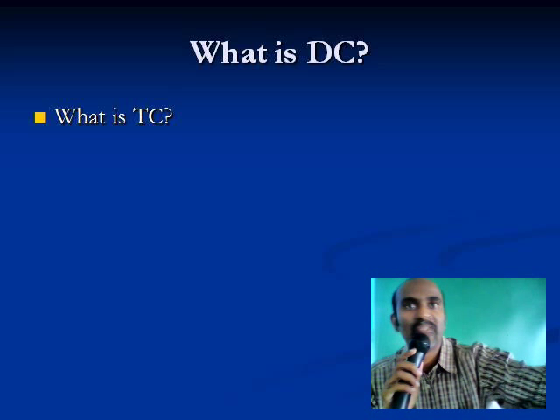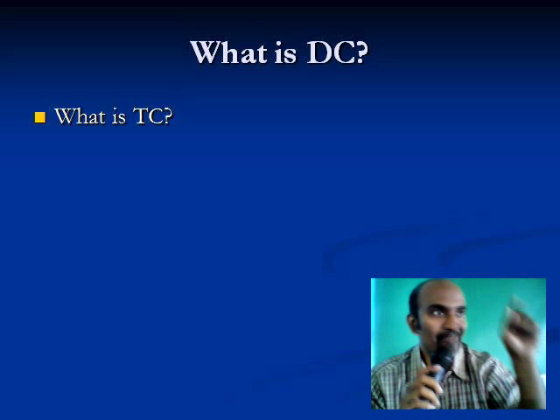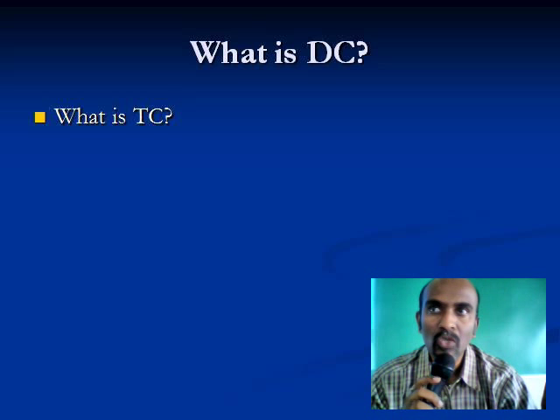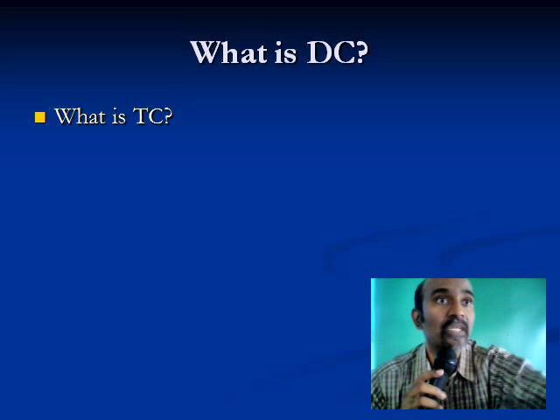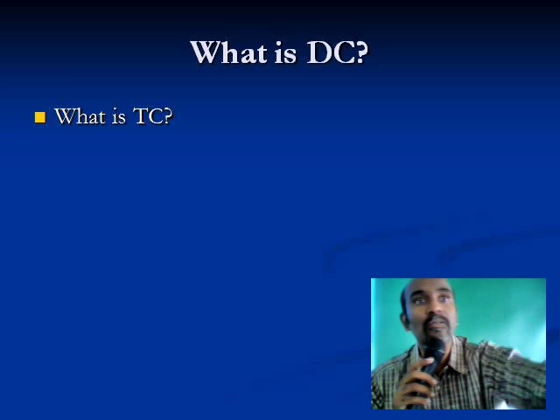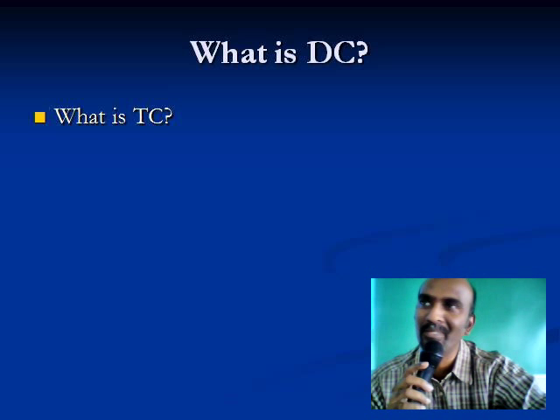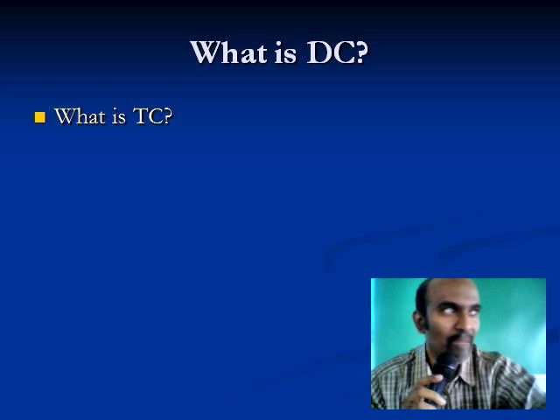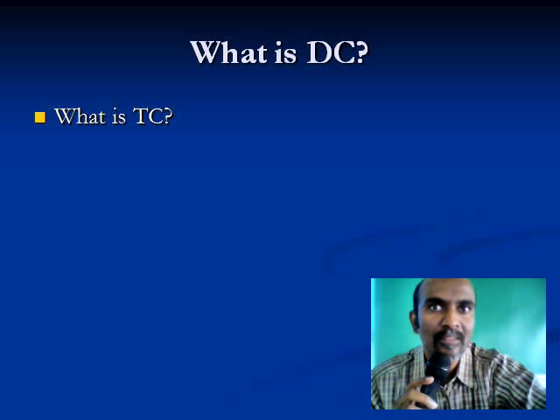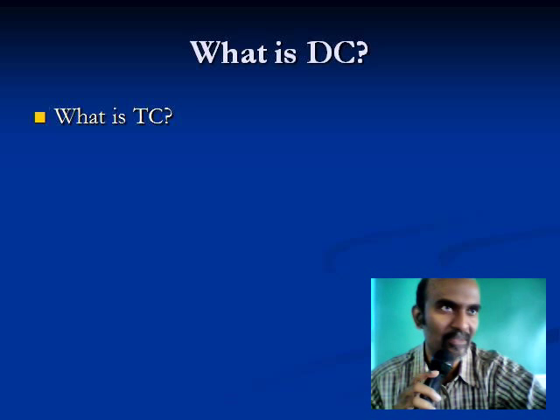We have read neutrophils, eosinophils, etc. And we want to find out how many neutrophils per millimeter cube, how many eosinophils per millimeter cube. That is not differential count. If you count that, it becomes absolute neutrophil count, absolute eosinophil count. Do you understand? Per millimeter cube. Understood? That is not differential count. Per millimeter cube, how many eosinophils are there? That is absolute eosinophil count. That's a separate experiment. It's not there for you.